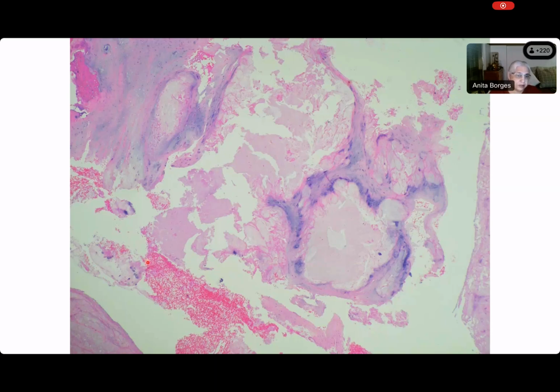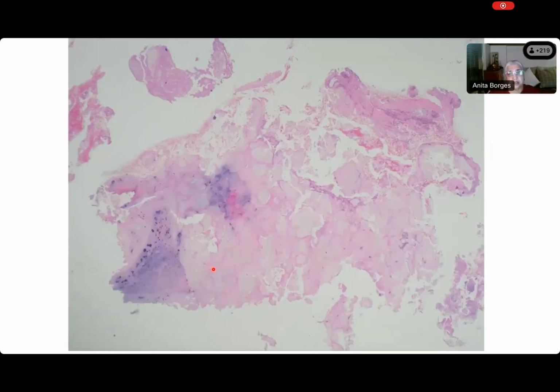Mansi is finding it difficult to do it. Come on, Zara, help Mansi out. What are you seeing? Ma'am, there are acellular areas comprising amorphous, pale eosinophilic material. Fantastic. So what you're seeing is nodules and sheets. Here you have nodules, and together they are confluent nodules of pale eosinophilic pink material. Yes, it's eosinophilic, but extremely pale. In some places, it's not even eosinophilic. It's grayish.